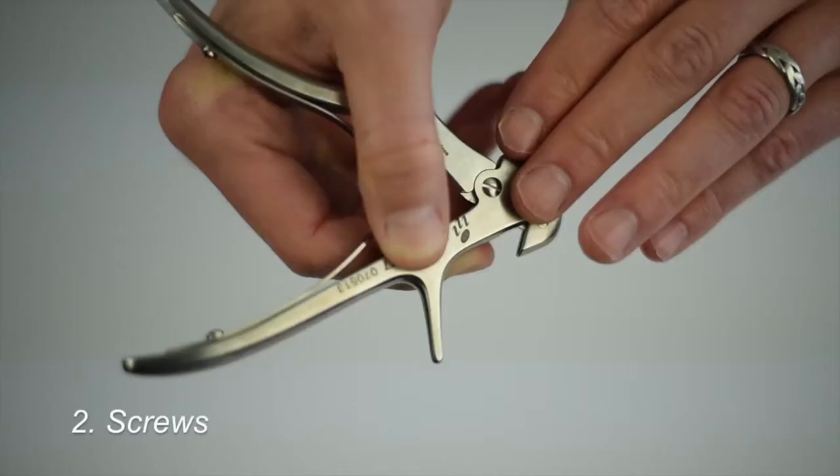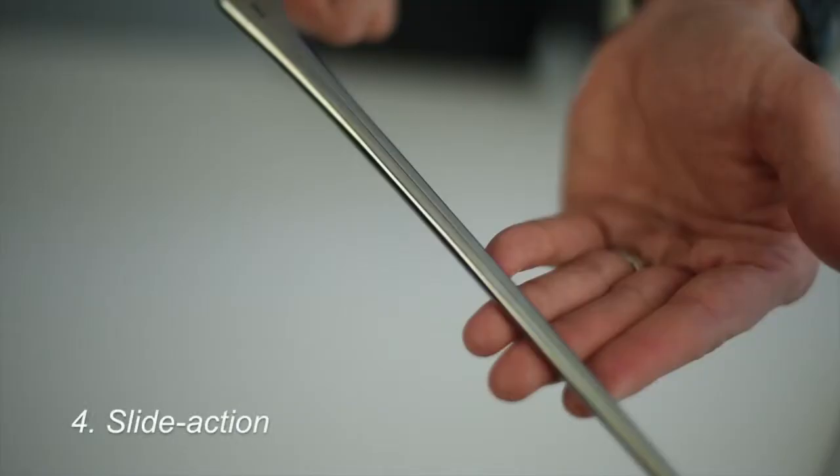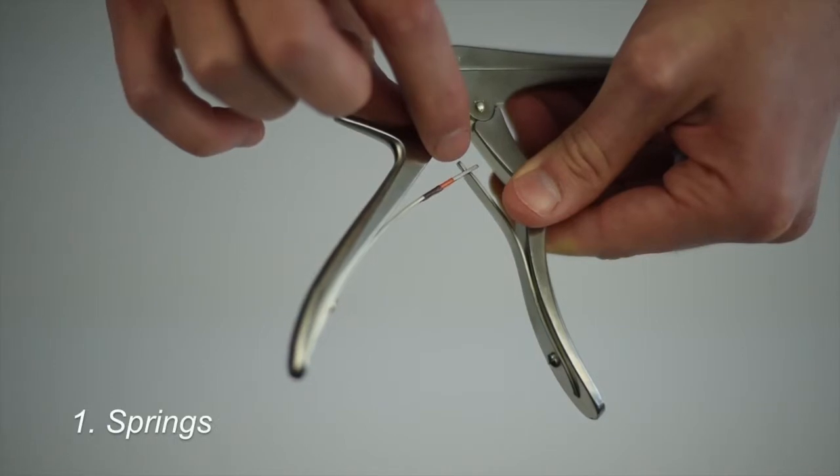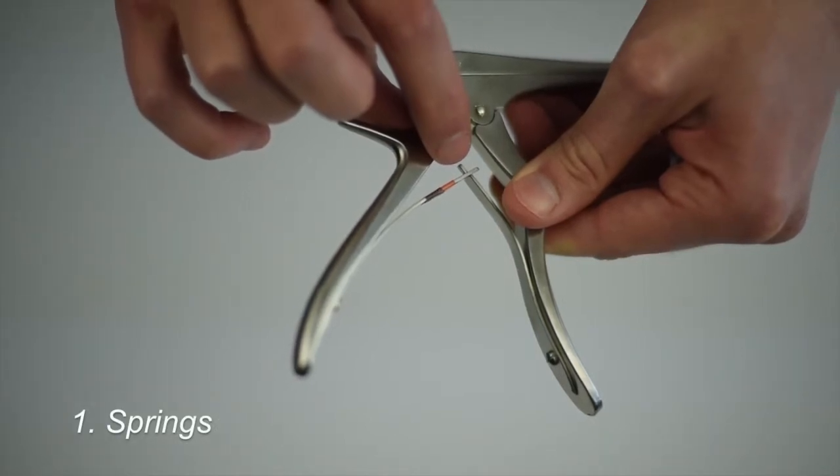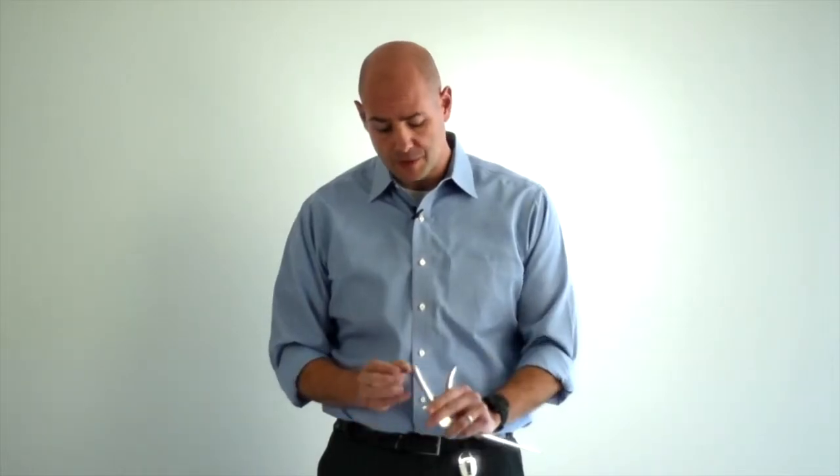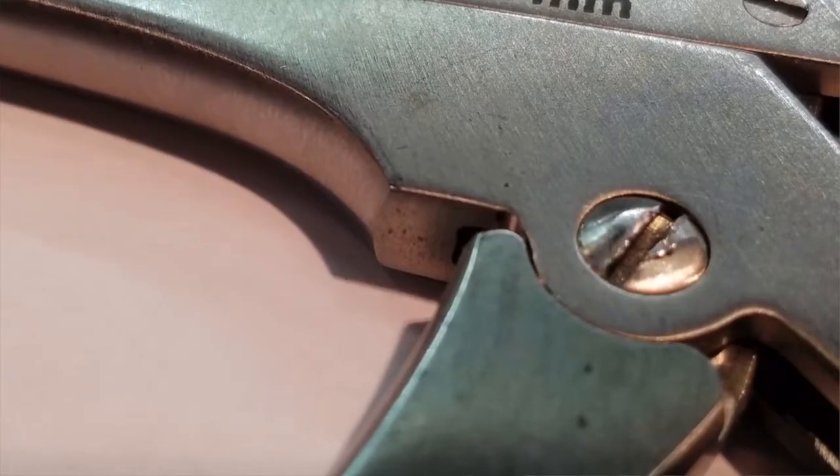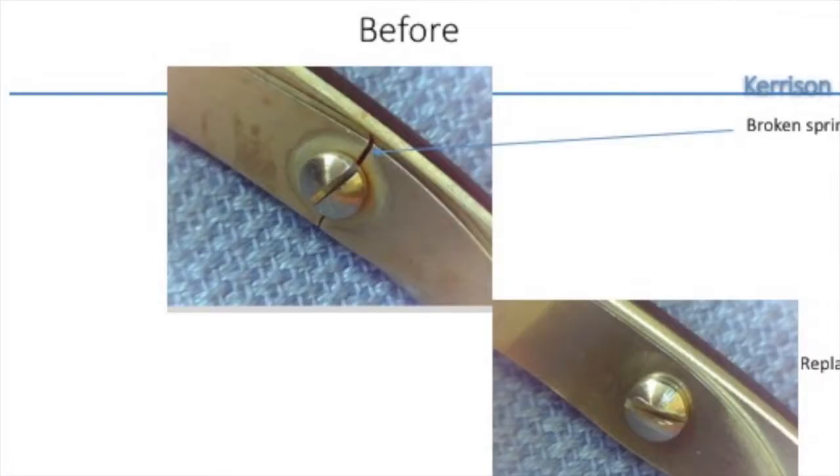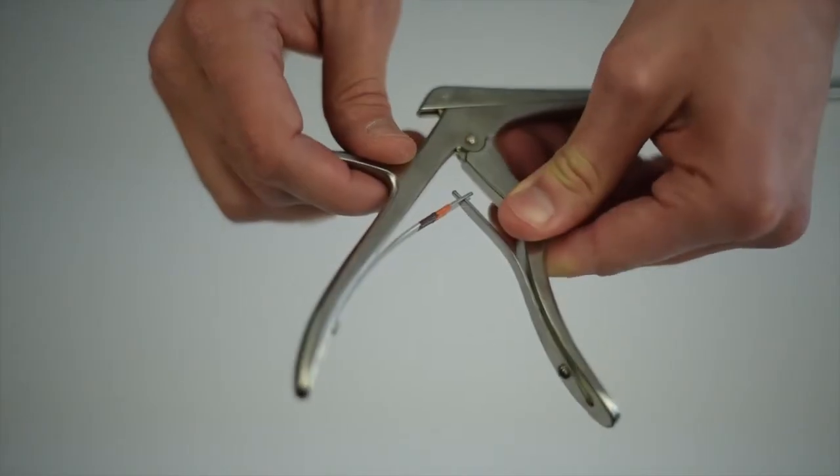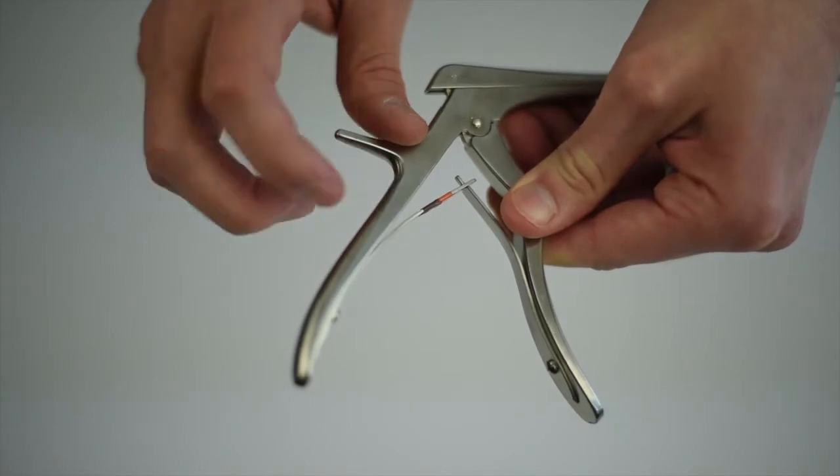There are four inspection points on a Kerison Rongeur that are key to making sure it works right. Many times what you see in the springs is either a burr on the screws that hold the springs in, or a crack in the spring due to sterilization or the age of the instrument. Additionally, on the spring you want to make sure that they meet correctly.